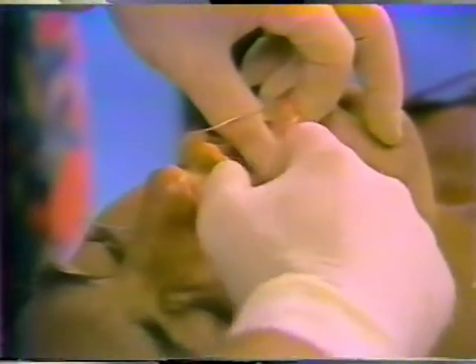After verification of electrode placement accuracy, the laryngoscope is removed from the subject. A custom-made dental appliance that fits over the mandibular molars is constructed for each patient so that the electrode wires from the posterior cricoarytenoid muscle will be routed from the oropharynx along a pathway between the teeth and cheek, to prevent the subject's accidental biting through the electrode wires because of this anesthetized oropharyngeal region.